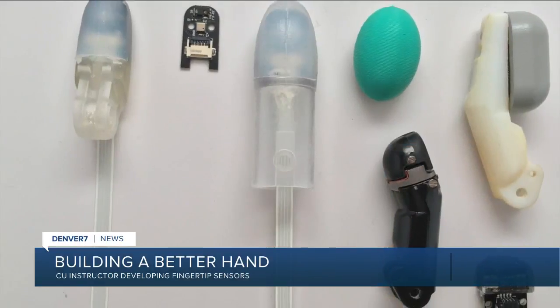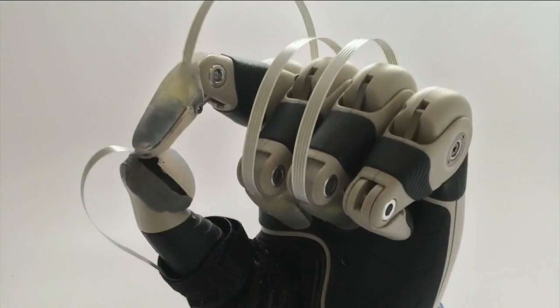An instructor at CU is working on building a better prosthetic hand. Engineers are creating fingerprint sensors to give people back their sense of touch.